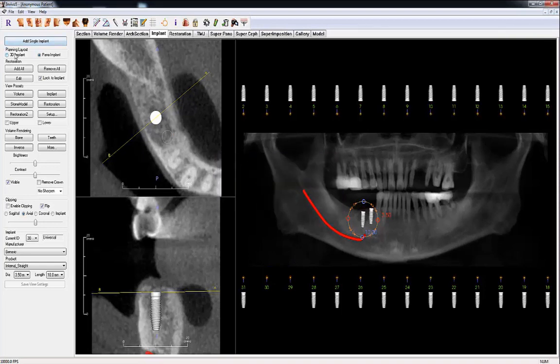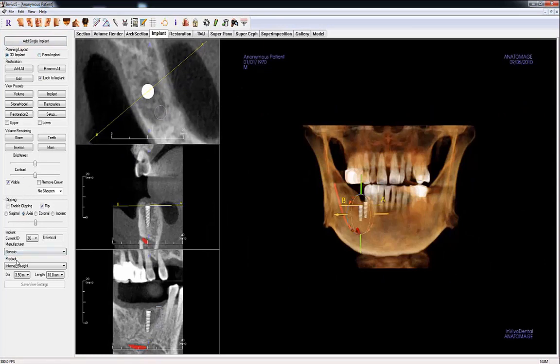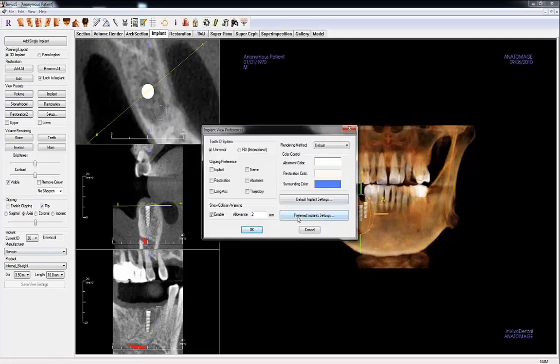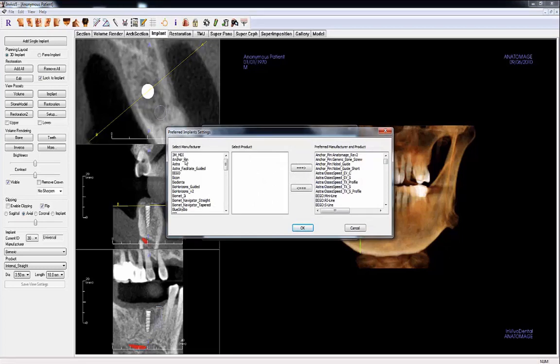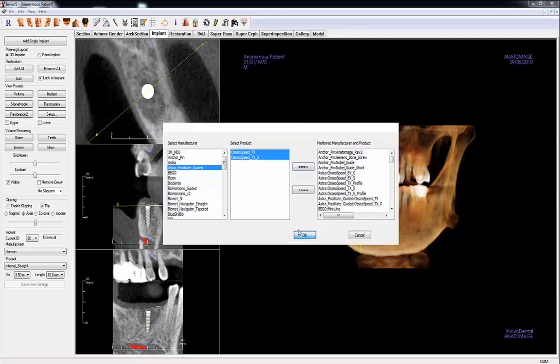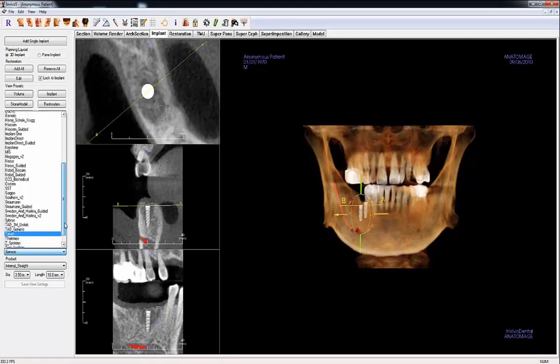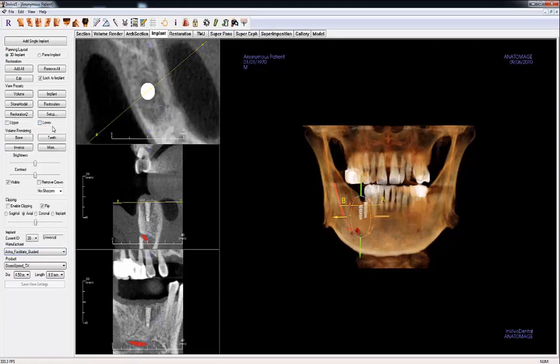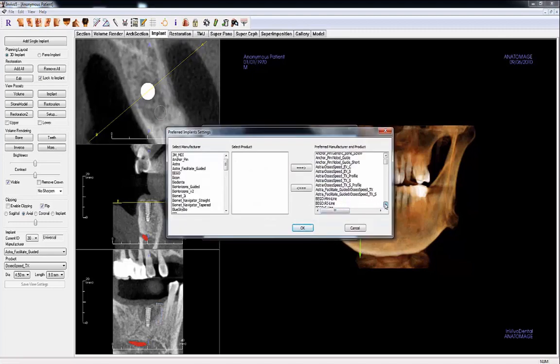To edit which manufacturers and implants appear in the drop-down menu, click Preferences, then Preferred Implant Settings. The manufacturers are divided into guided and non-guided options to indicate kit compatibility. All listed implants are compatible with the Anatomage kit. Some implants are listed as guided to additionally indicate compatibility with the manufacturer's guide kit. To add the Astra Guided Implants, click on Astra Facilitate Guided to display available products. Select the implants you are interested in and click the arrow pointing right. Your implants will now show up in your drop-down menu. You can also use this dialog to reduce the number of implants or manufacturers that appear.